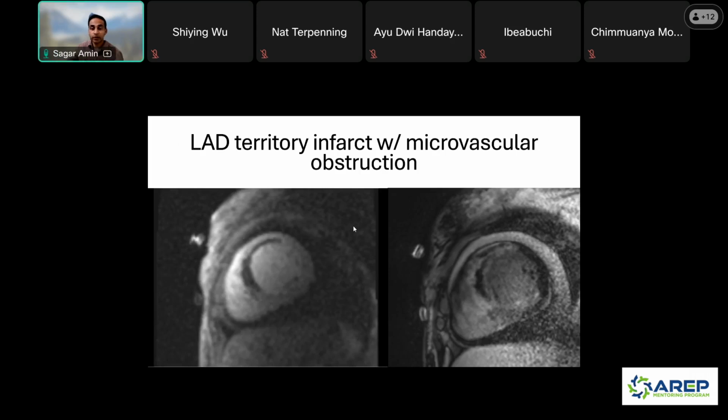So we got a cardiac MRI to confirm. And you can see that this area is not perfusing. Usually, cardiac MRI is a pretty extensive and complex exam to do, but we do a few of them every day, and it's becoming more common in our practice. Usually the way we do it, we'll get a bunch of images, look at them as a movie clip, a cine, and then we give contrast. And then after about 10 minutes, we'll get delayed sequences to see if there's any enhancement.